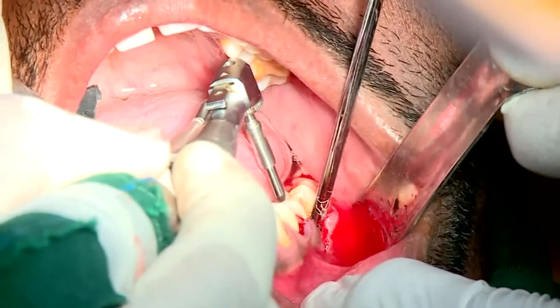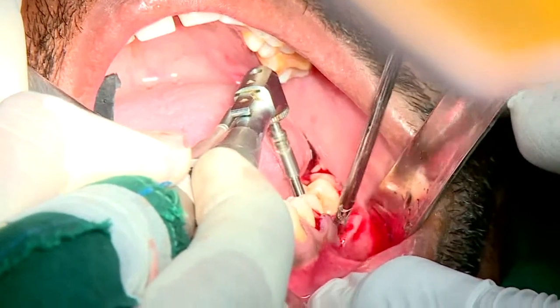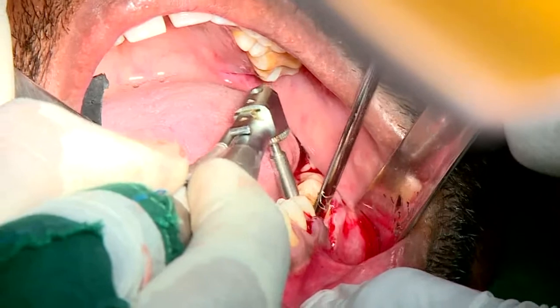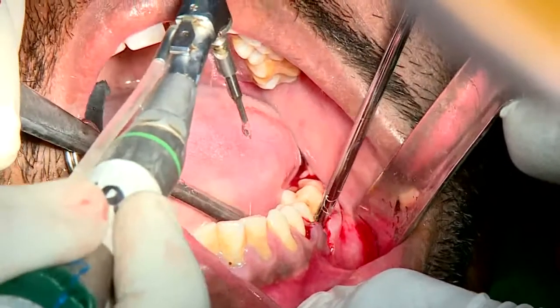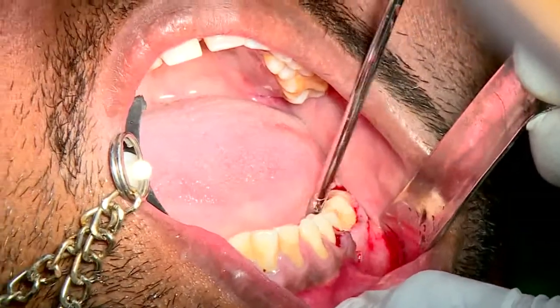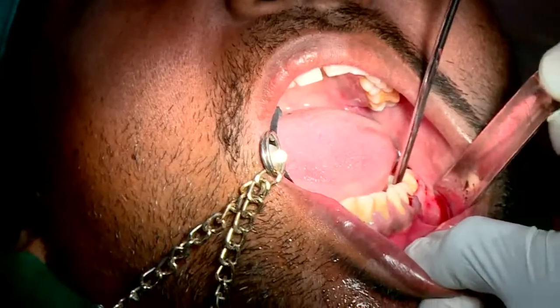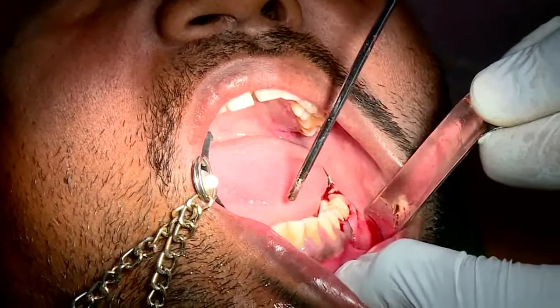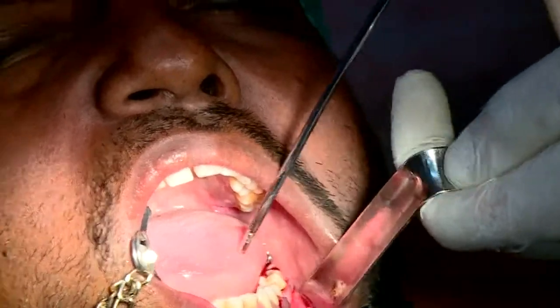So sir is starting with the first drill, the initial drill for most implants. The beauty of this drill is that it is sharp, unlike the other drills which are not as sharp at the tip. So you can enter the cortex, and its purpose is just to puncture the cortex. Once you get into the cancellous bone, you can take it out and go for the regular pilot drills, and sequentially you can expand the osteotomy.